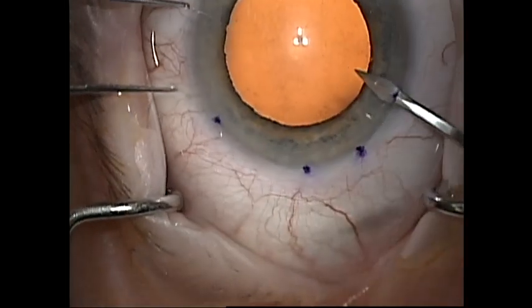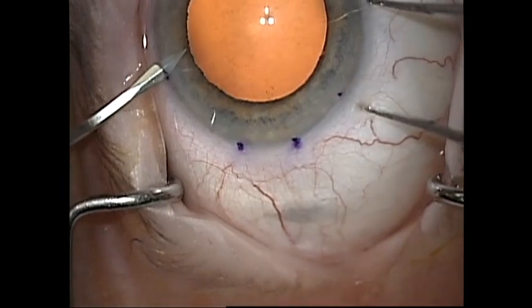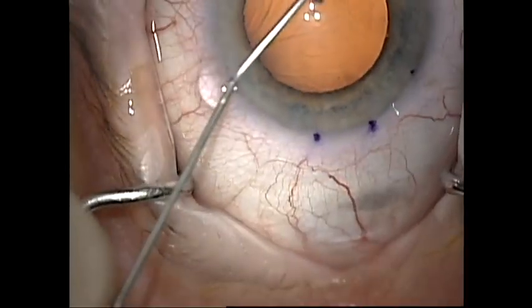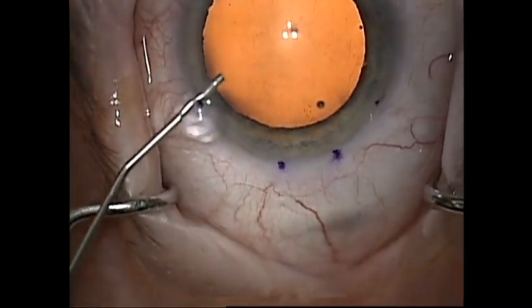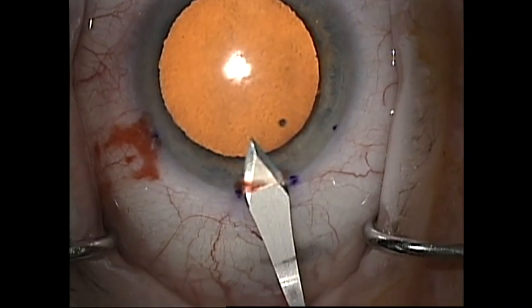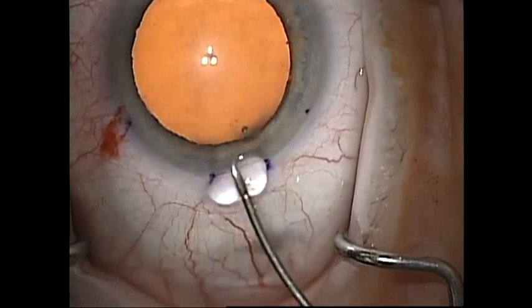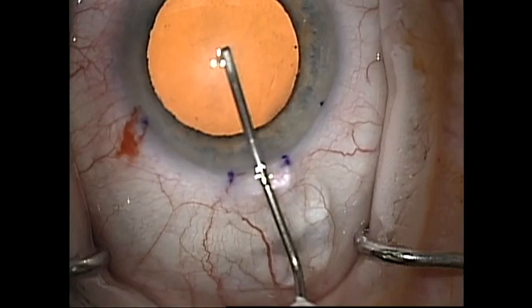I start my surgeries by marking the area for the incision for the paracenteses and the main wound. I like to make 1 mm paracenteses. I then fill the eye with a cohesive viscoelastic such as Helon. No dispersive viscoelastic should be used as it can interfere with DMEC graft attachment. I then make my main incision with a 2.4 mm keratome when doing a DMEC triple procedure.